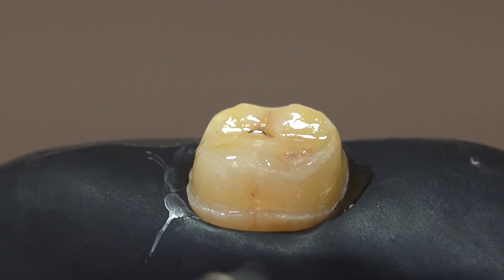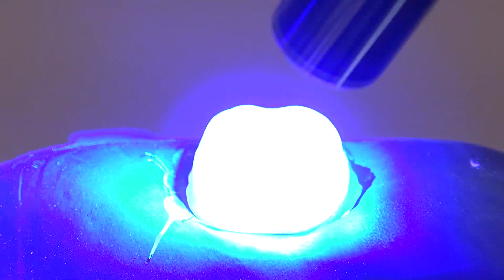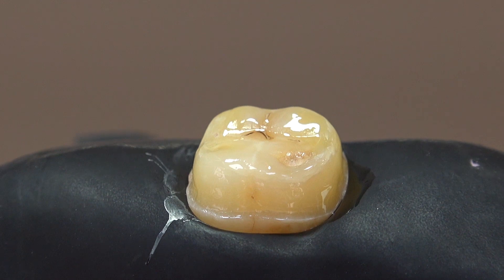It is advised to cover the whole surface with a thin glycerin layer. Otherwise, the unpolymerized layer at the surface may react with the co-monomers in the impression material and negatively affect the accuracy. Now we have a protective layer through which bacterial products cannot penetrate. A temporary restoration may now be cemented where necessary.